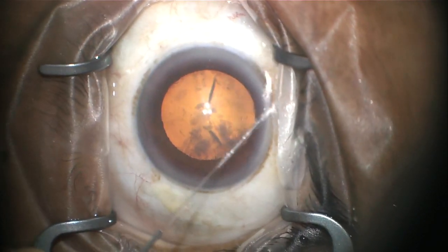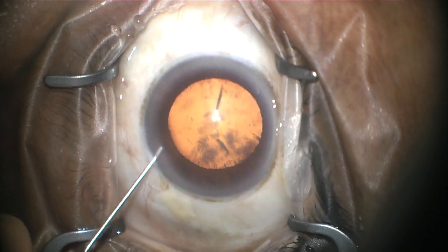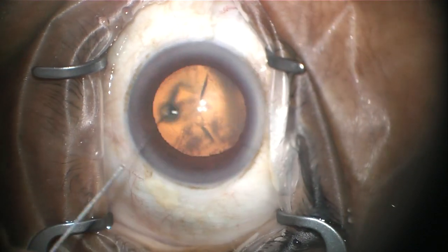Lidocaine, which is a numbing medication, is then injected into the eye. This ensures that there's adequate anesthesia during the entire procedure.